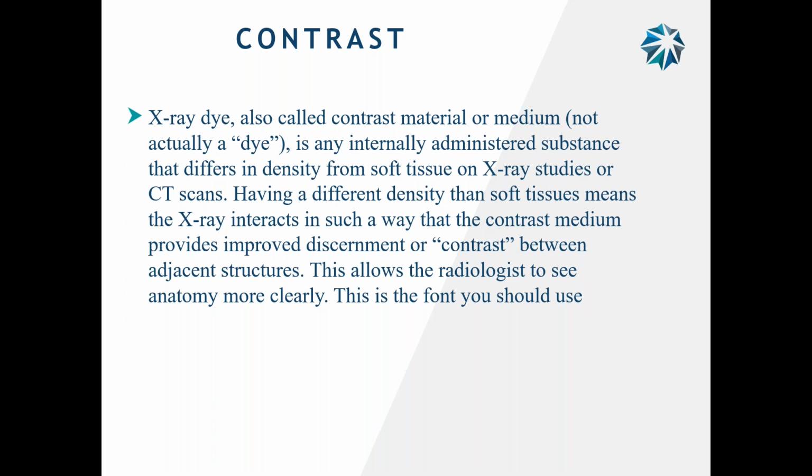It's a material that is injected into the body to provide contrast to soft tissue. And how does it do that? In an X-ray or CT, how does it give you that contrast in the body? It attenuates the X-ray. Now, what does attenuate the X-ray mean?